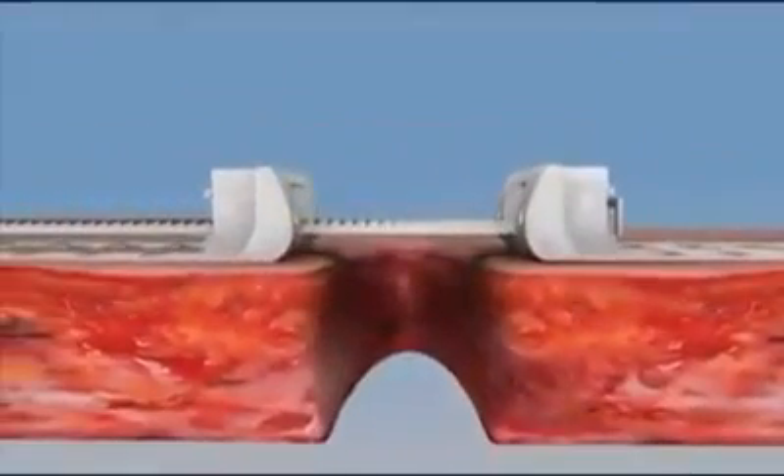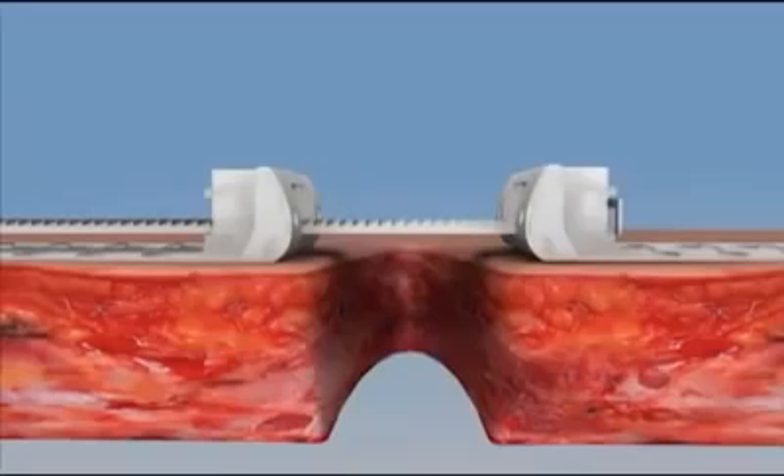The strap is inserted through the lock-release mechanism of one plate to the far plate. The system is used for the gradual approximation of wound edges when the edges are under significant tension, preventing primary closure.